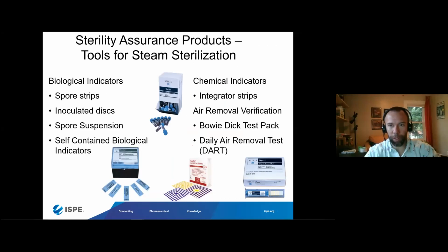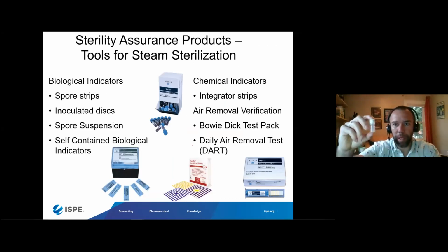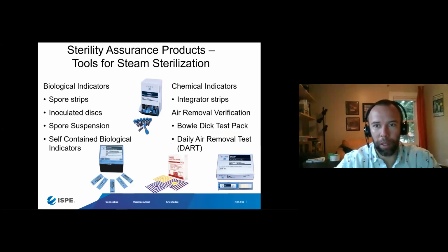We also have what's called a rapid read biological indicator. This is a self-contained version as well. And this has a readout of 20 minutes, so very quick there.